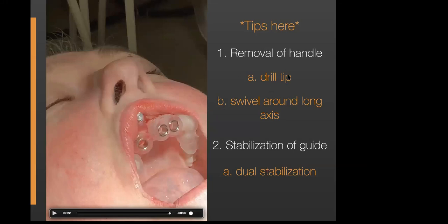So I use the drill tip. I remove the guide by swiveling it around the long axis. I didn't go up and down with the guide. Swivel it and slide it out. Stabilization of the guide, dual stabilization. Let's watch it together.